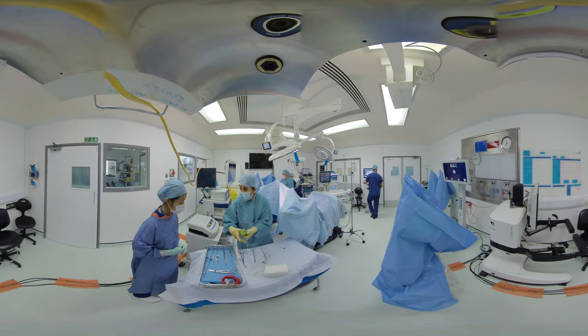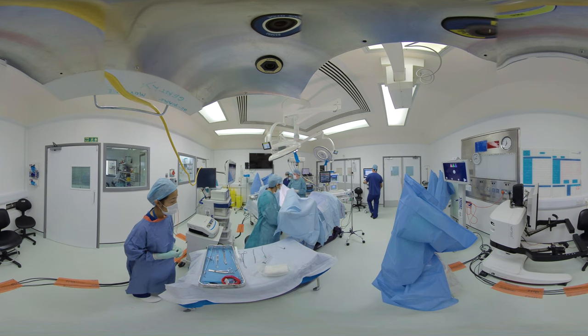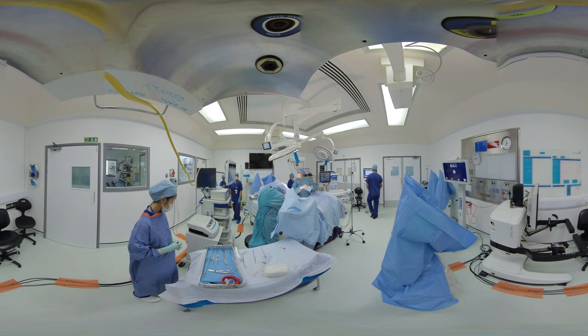This is the step where we're putting a uterine manipulator to help us with manipulating the uterus during surgery. This is a V-Care manipulator that we're using.